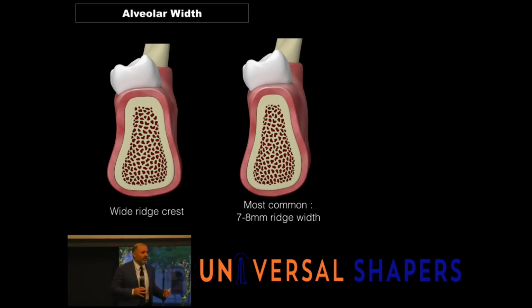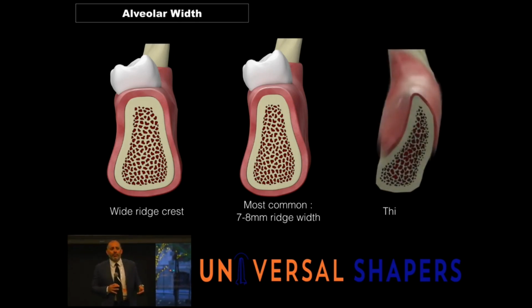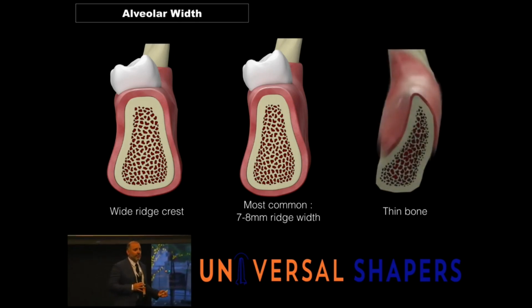Or we have to augment, either with hard and soft tissue or separately. So that's the most common one. Then we have the thin ridges. And for those, we know what we have to do. There's really no magic. There's different techniques. We'll go over a couple today that we can treat for those.